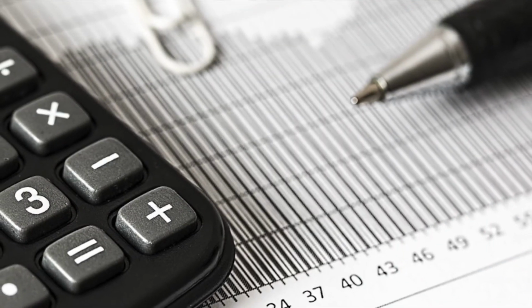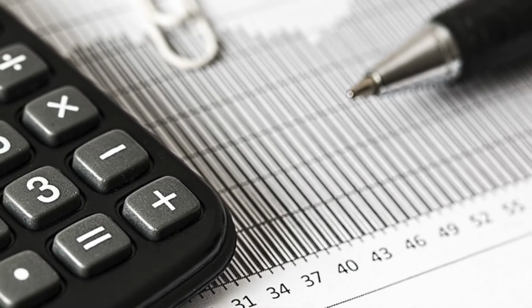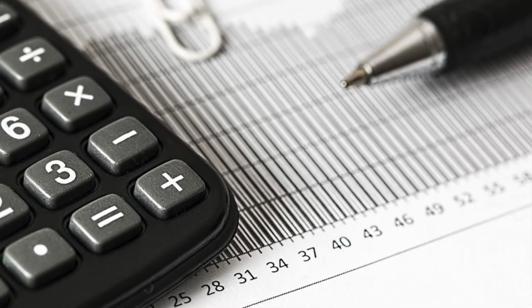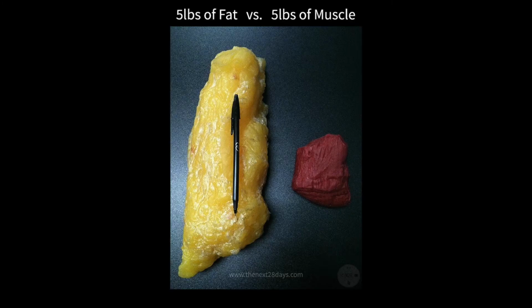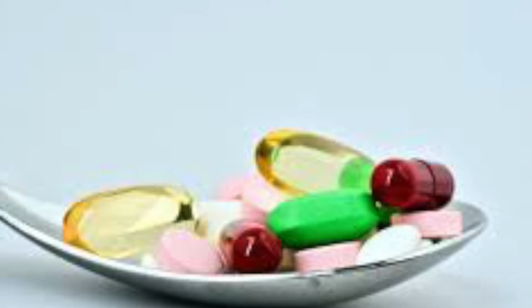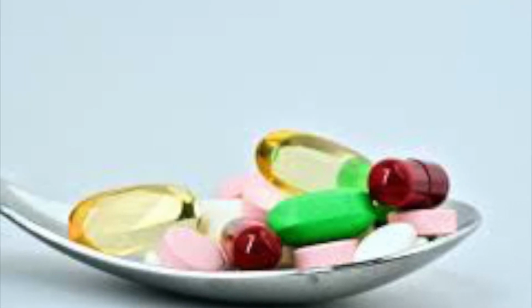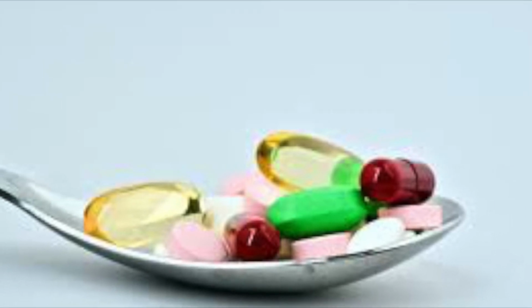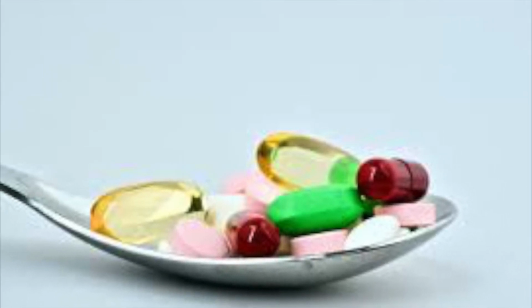Once body volume is determined, body density can be calculated and inserted into an equation to provide percent fat measurements. Considering fat and non-fat have different densities, percentage of body fat versus non-fat can be determined. The non-fat components include minerals, protein, and water. In order to complete the calculations, assumptions that fat-free components are the same as the reference standards must be made.